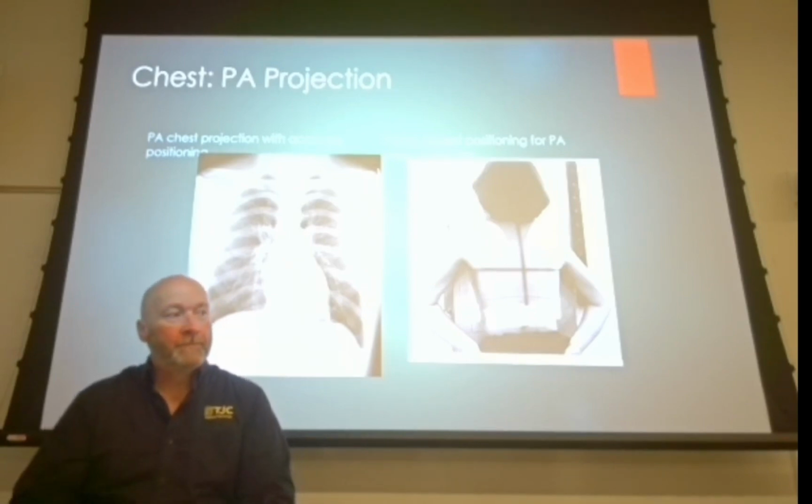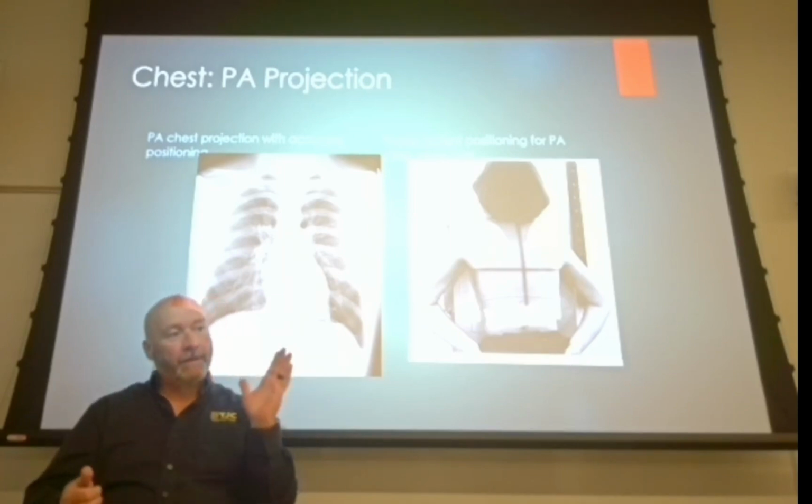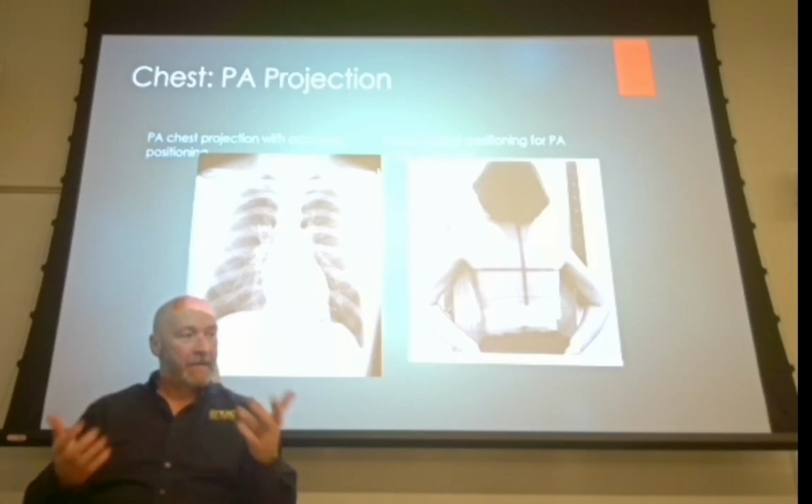So don't do that. Set the bed up a little bit, pull the patient forward, put the image receptor behind the patient, set the bed the rest of the way up, adjust the image receptor, and then get ready to make your exposure.